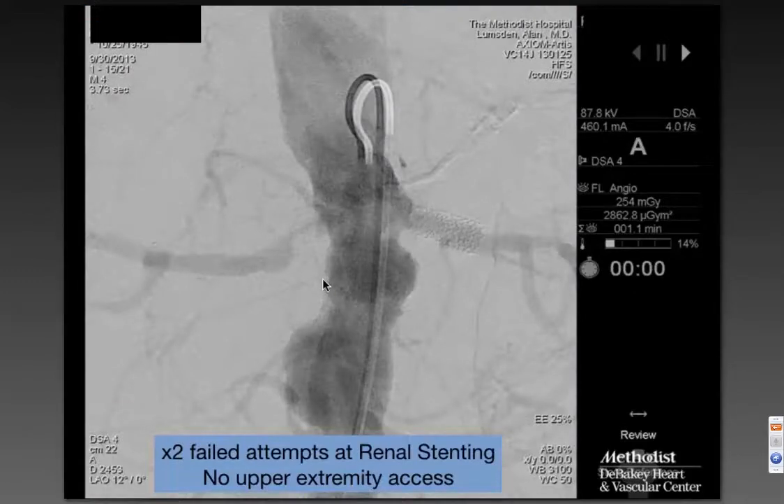Here's a patient of mine — a fairly complex lady I'd known for many years. She had occlusion of all of her supraortic trunks, so upper arm access was not an option. She had previously had stenting of her left renal, and she came back with malignant hypertension. You can see the disease in her aorta, and she had a complex renal artery stenosis.